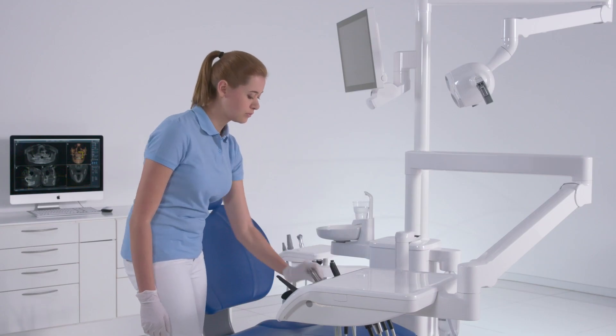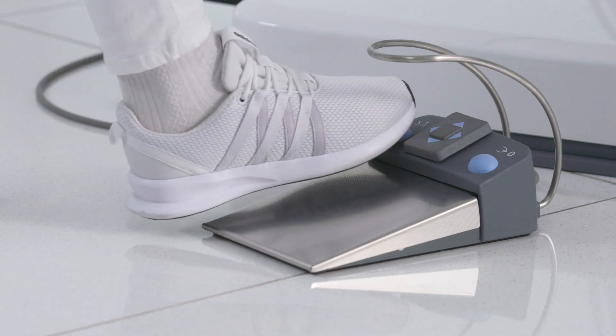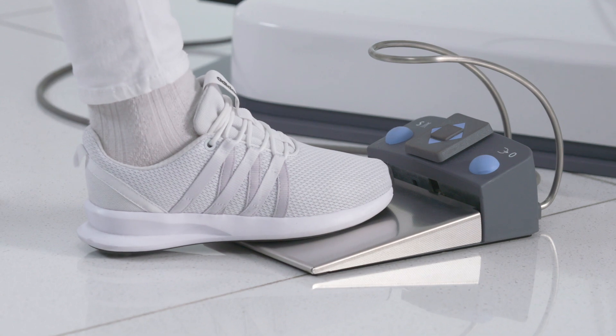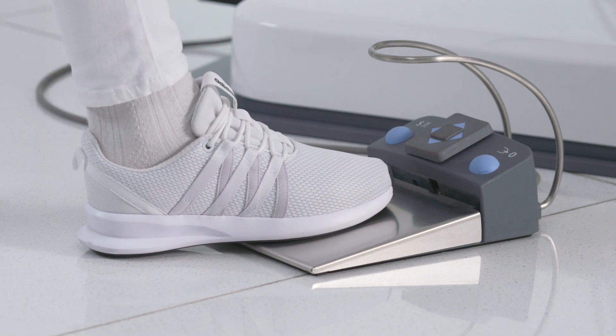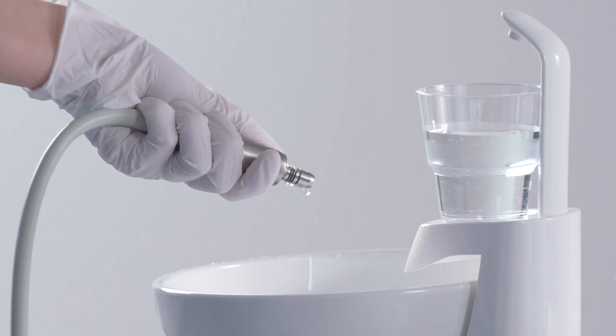Take the instruments out one by one and hold them over the cuspidor. Activate the spray with the foot control, then keep the foot control pressed for at least 60 seconds. Repeat the procedure for all other instruments.